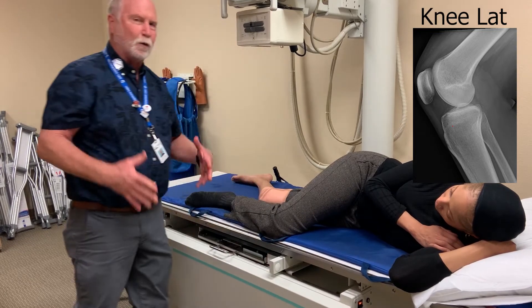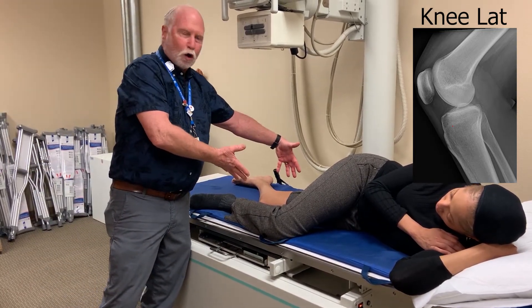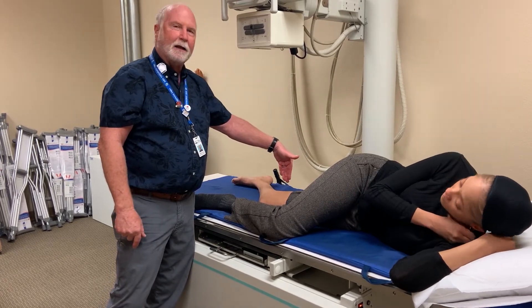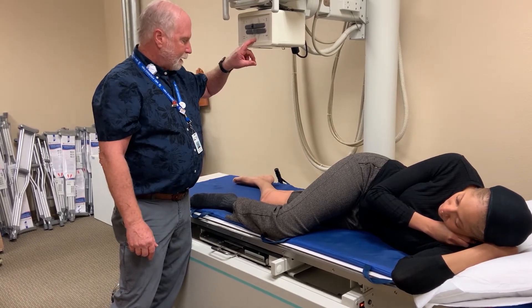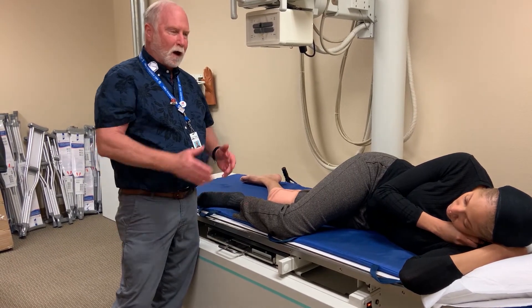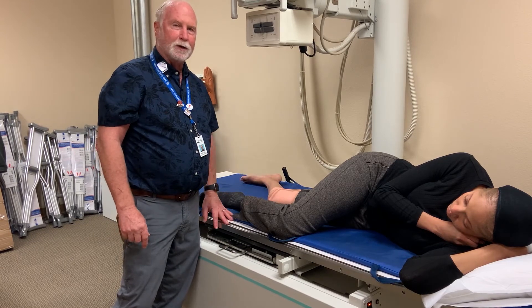Be aware too — if you have a really large leg, all the bony anatomy is anterior. So if you center in the center of that leg, you're going to miss the patella and even maybe part of the femoral condyle. Nikki's pretty easy — you can see where that bony anatomy is really well. Just be aware: if you have a really large leg, do not center in the middle of the leg. Center anteriorly. That's where the bony structure is going to be.